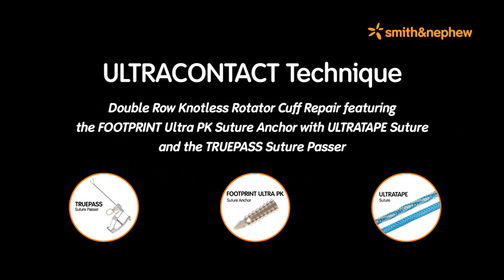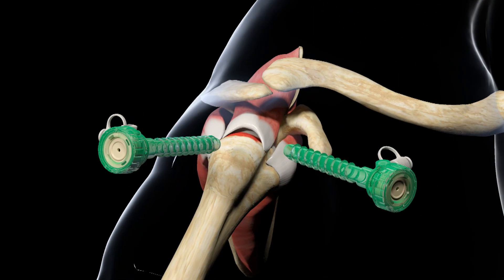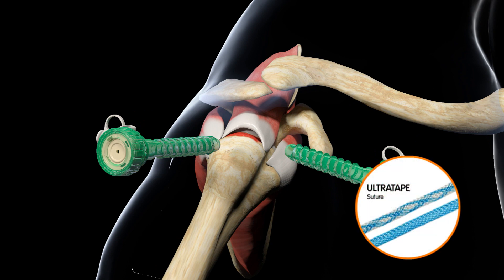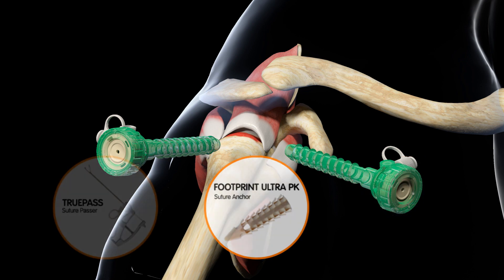Double row knotless rotator cuff repair featuring the Footprint Ultra PK suture anchor with Ultra Tape suture and the TruePass suture passer. In this Smith & Nephew rotator cuff repair technique animation, the knotless repair of a crescent-shaped tear in the supraspinatus tendon will be demonstrated. This repair will utilize Ultra Tape, a flat uniformly woven suture tape designed to increase tendon-to-bone contact, the Footprint Ultra PK suture anchor with interlocking screw technology.